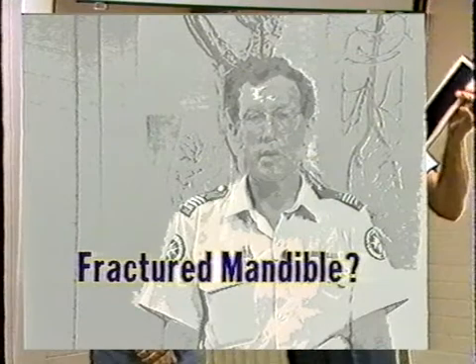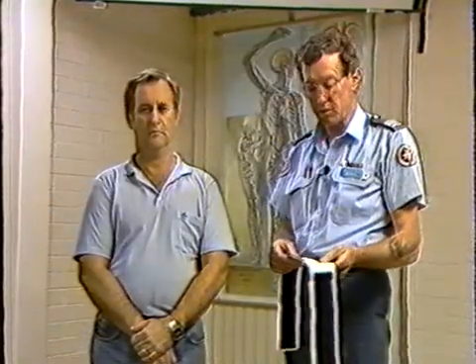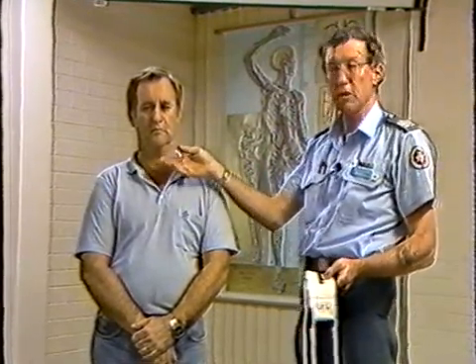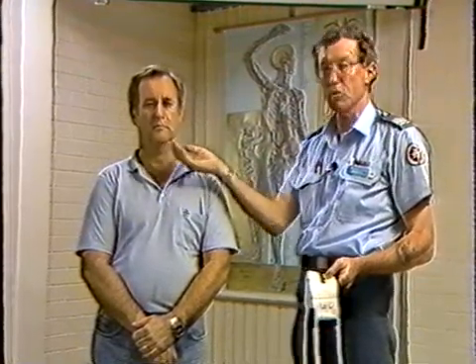You'll notice it has a special window made in the middle here. One of the uses for the window is for immobilisation and support of a fractured mandible. As we know, when the mandible is broken, we can pretty well diagnose it by asking them to just bite their teeth, and they'll have an abnormal bite. So all we need to achieve is just to take the weight of the mandible to stop it swinging.